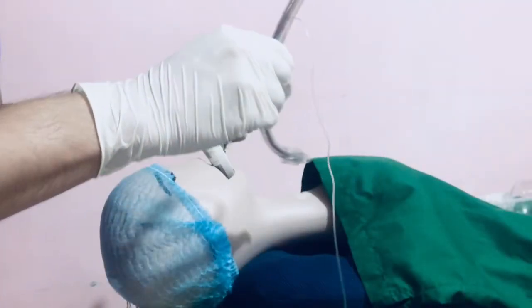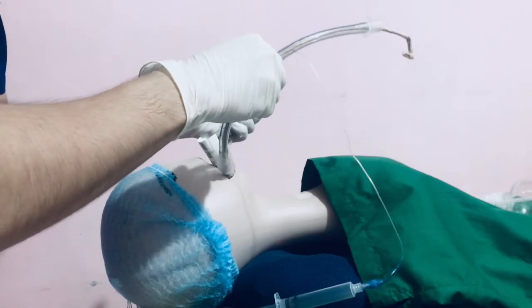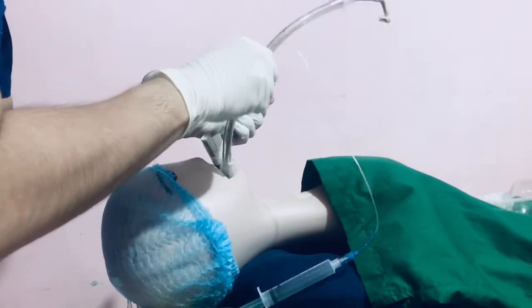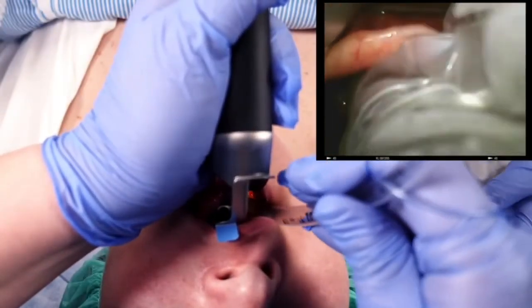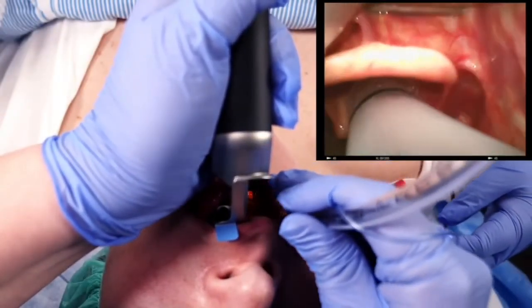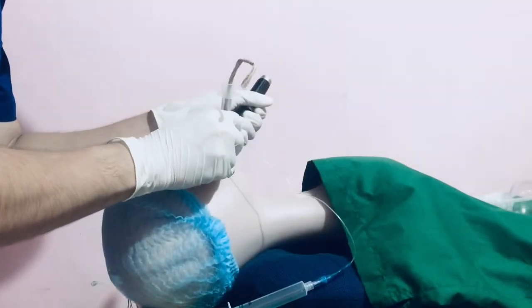Hold the ET tube with your right hand in a pencil grip. Insert the ET tube on the right corner of the mouth and guide the tip toward the glottic opening. Advance further until the cuff is about 3 to 4 centimeters beyond the vocal cords. The ET tube should be about 21 to 22 cm in.